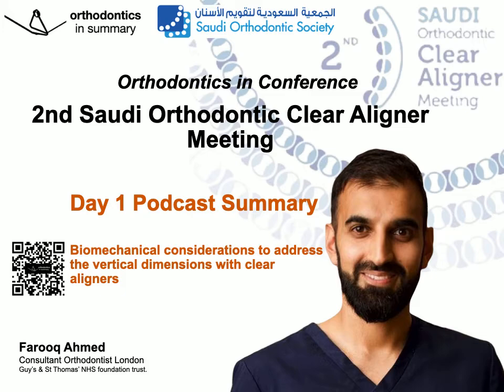So how do we correct this? Well, Maz mentioned that for Invisalign at least, they have optimized attachments, which usually contain an extrusive vector with their rotational movements. If we looked at conventional attachments, well, what we're describing is essentially a force going from the gingival aspect to the incisal aspect. So gingivally faced bevel to provide an extrusive force is what we're looking at.